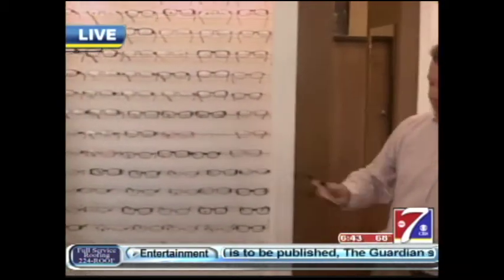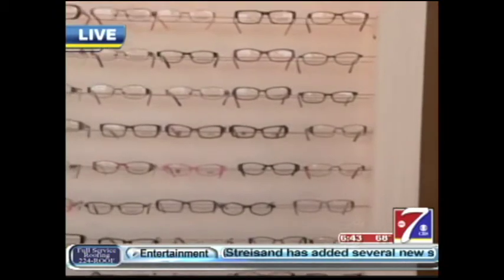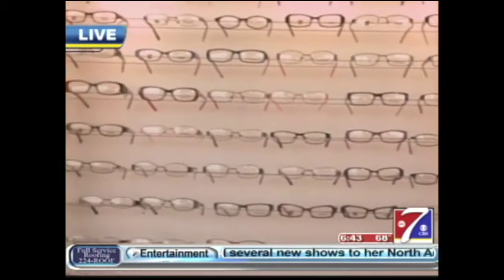So even if they necessarily don't fit the back of the ear, you can still fit them to fit the kid. Yeah, correct. Yeah, there's multiple different styles of frames that would do that. Some are a little more difficult than others. We have to use a little bit more heat on the metal. But like I said, the plastic frames and of course these frames with these hook earpieces do the best job.